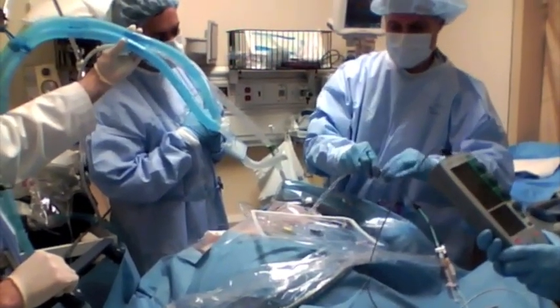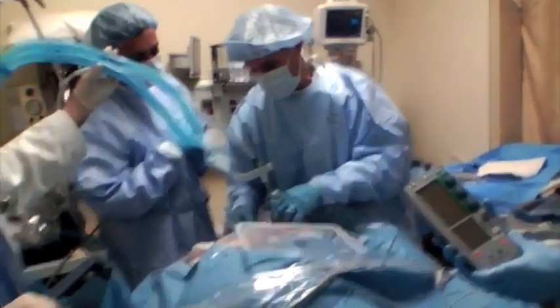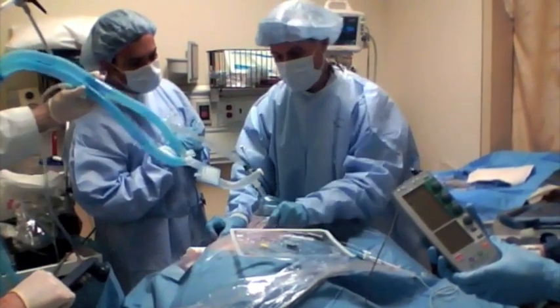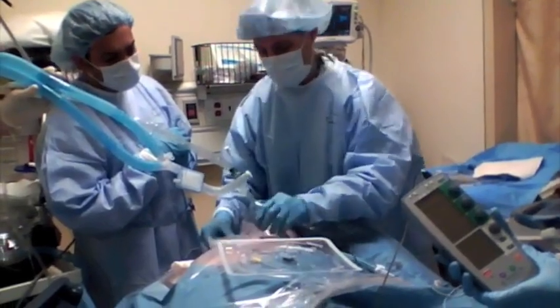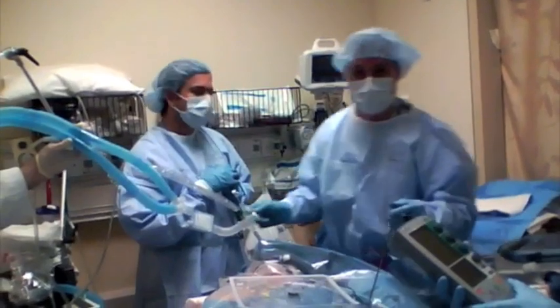Now we'll take and suture this in place. Once it's in place, we'll coil this wire so that if somebody hits it, it will just pull the coil off — it won't pull the pacer wire out. Now he's got a heart rate of 80. Thank you very much.